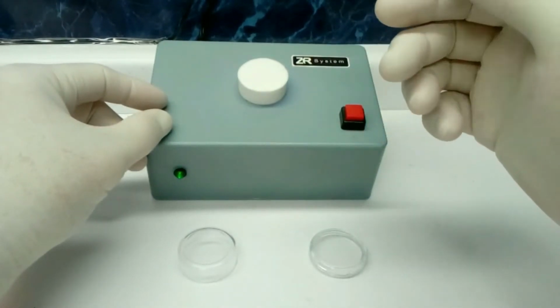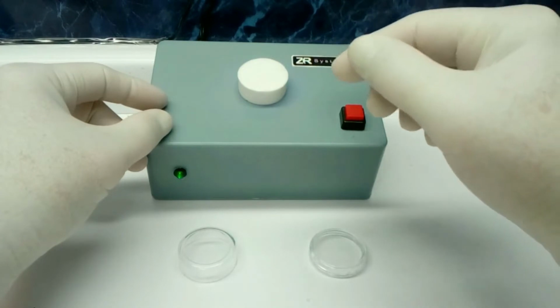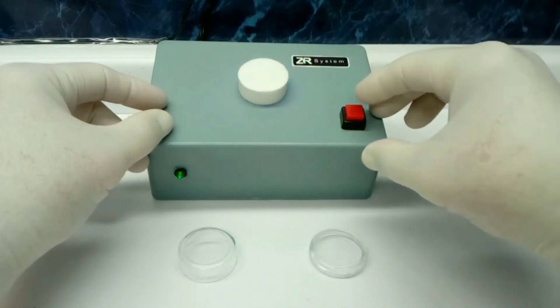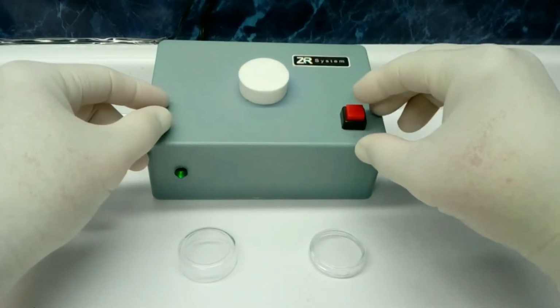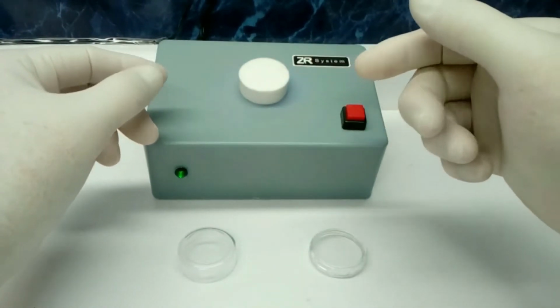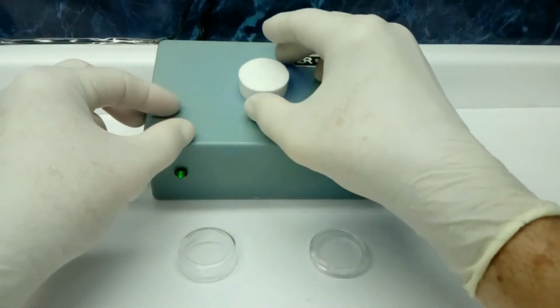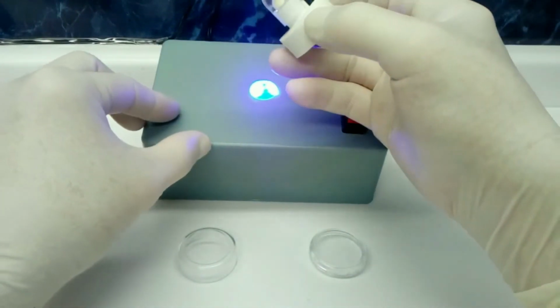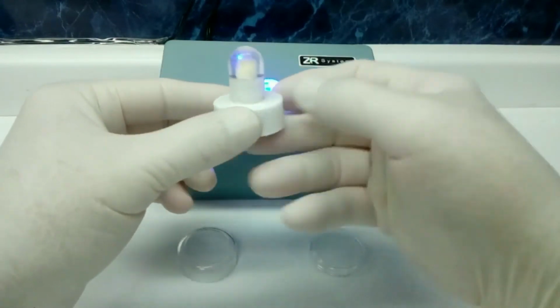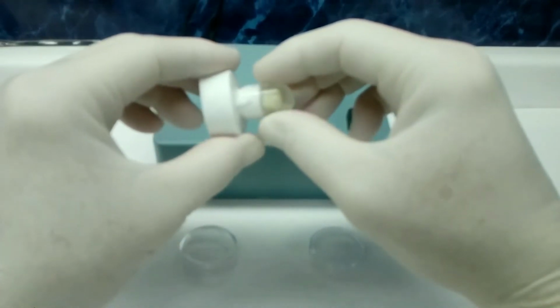The intense blue light activates chemical mediators characteristic of the resin that make it solidify structurally in a few seconds. This process of solidification of the resin by light effect is called photopolymerization. At the end of the process, we simply remove the molds from the photopolymerization chamber, turn off the system, and separate the polymerization photo capsule from its counter capsule.